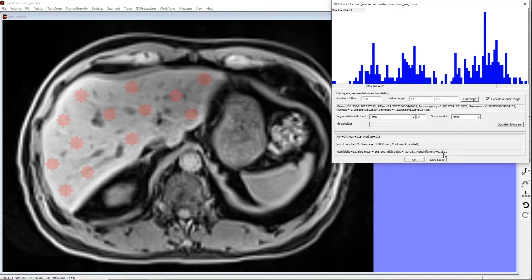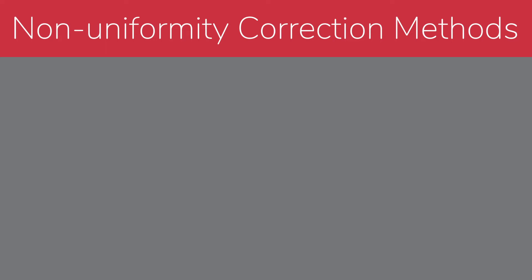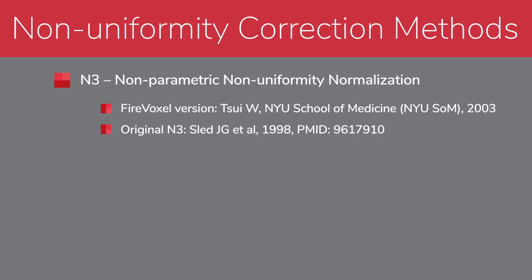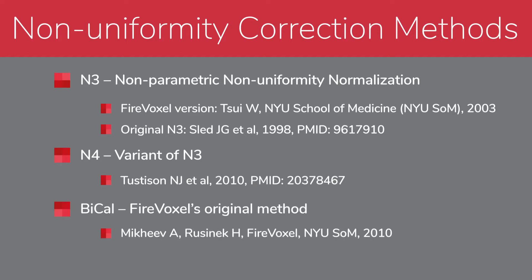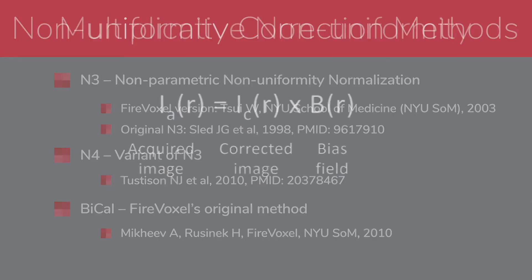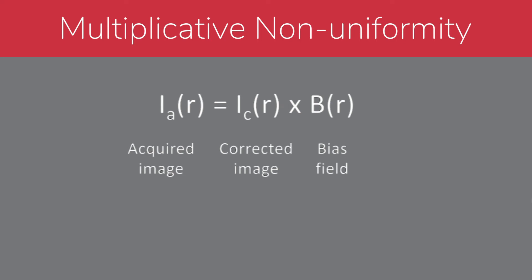The non-uniformity correction is expected to reduce the visual signal intensity variation, transform the histogram into a single narrower peak, and reduce the non-uniformity measure. FireVoxel offers three methods for non-uniformity correction: the widely used N3 method and its variant N4, as well as FireVoxel's original method named Baikal. These methods are retrospective and estimate the non-uniformities directly without the need for additional acquisitions. These methods assume that non-uniformity is multiplicative, meaning the intensity of the acquired image at every point can be represented as a product of the corrected intensity and a spatially varying bias field.